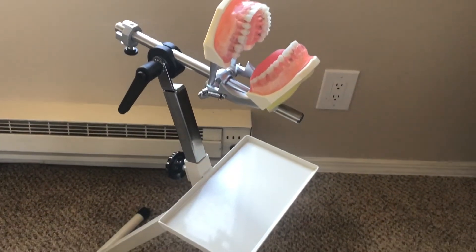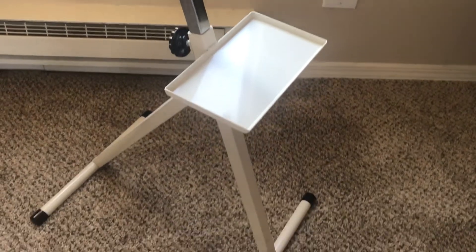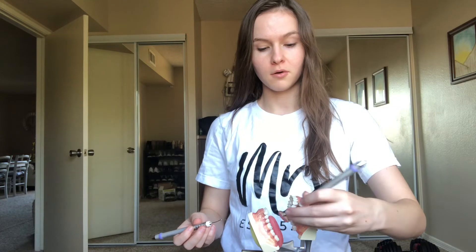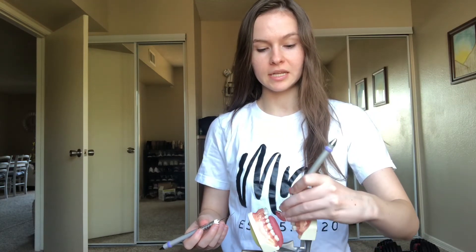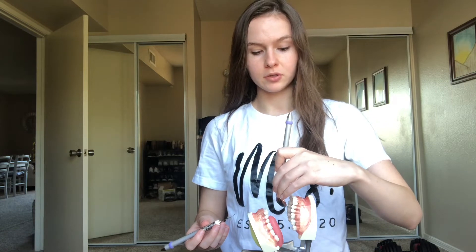Here is what the typodont stand looks like. I have my mirror and I have my periodontal probe, and I literally just go around the typodont using indirect vision when needed. I am able to practice how I would actually hold the instruments in an actual mouth.